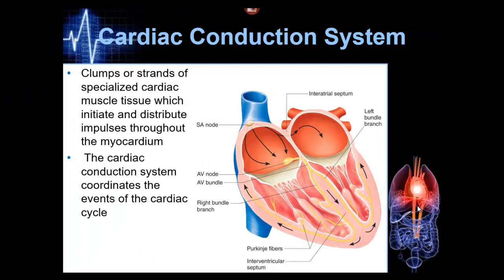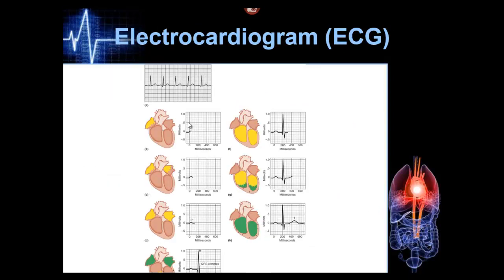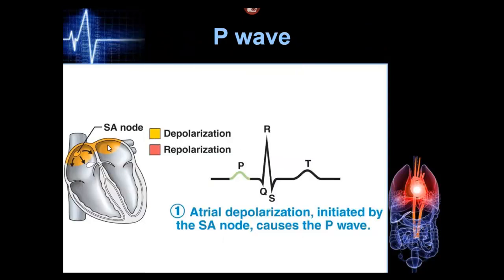So you're measuring this whole electrical system. It's picked up by the electrocardiograph. Here are all the steps, and there's one at the top. So like I was saying, here's the SA node sending out a signal. It's creating a P wave. It shows that the atria are contracting.